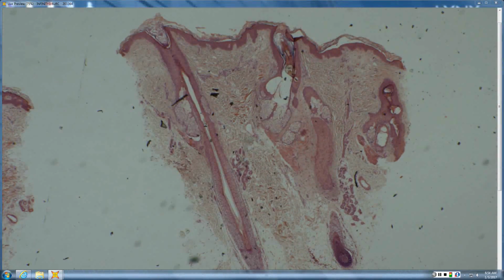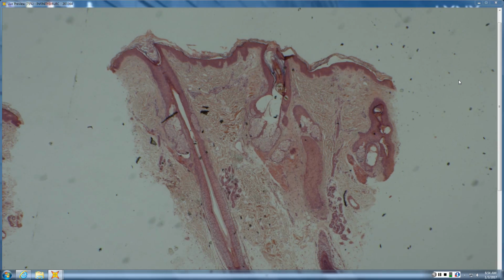The book really goes through, there's a really nice table in there that outlines those subtle differences. Because, and I'll get into what you see here in a second, you can see melanin within the fibrous tract remnants. You can even see trichomalacia to a certain extent in alopecia areata. So there's some things that overlap, so it can be a little confusing. But usually you do not see trichomalacia and large pigment casts in alopecia areata, although you can.